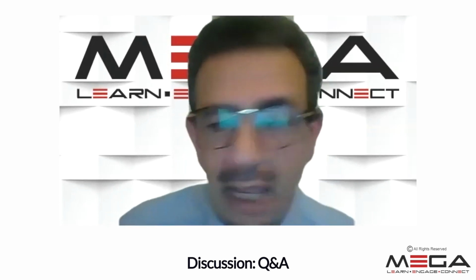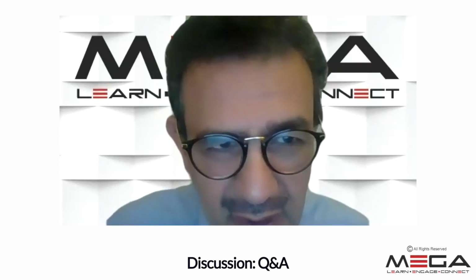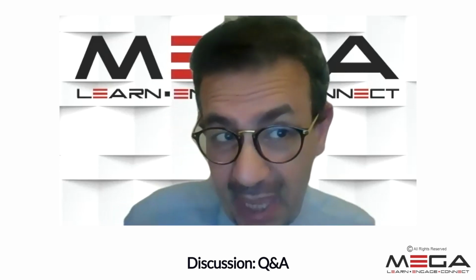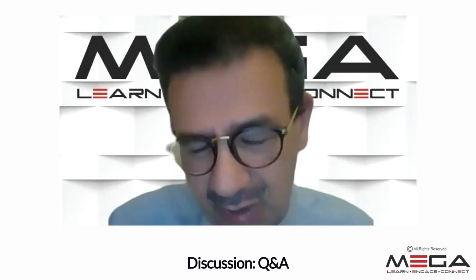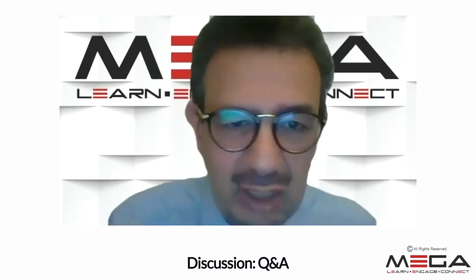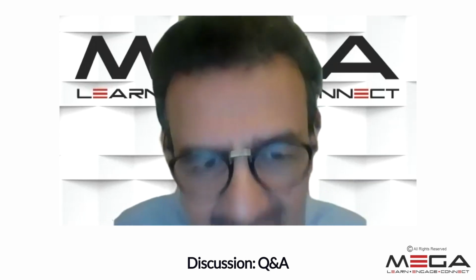That's amazing. Another question: in order to diagnose aortic dissections, especially type A, is it feasible? With the transesophageal echo it's going to be very easy and very feasible. But what about the transthoracic echo?